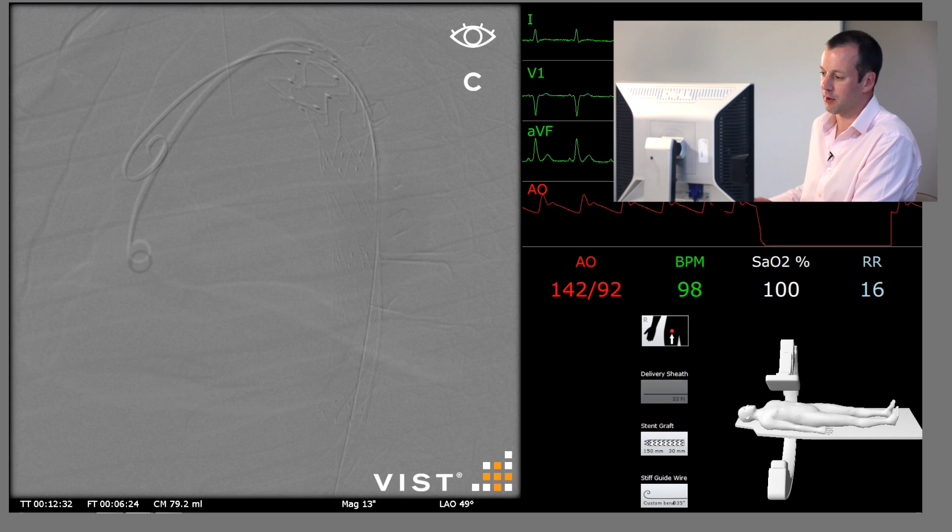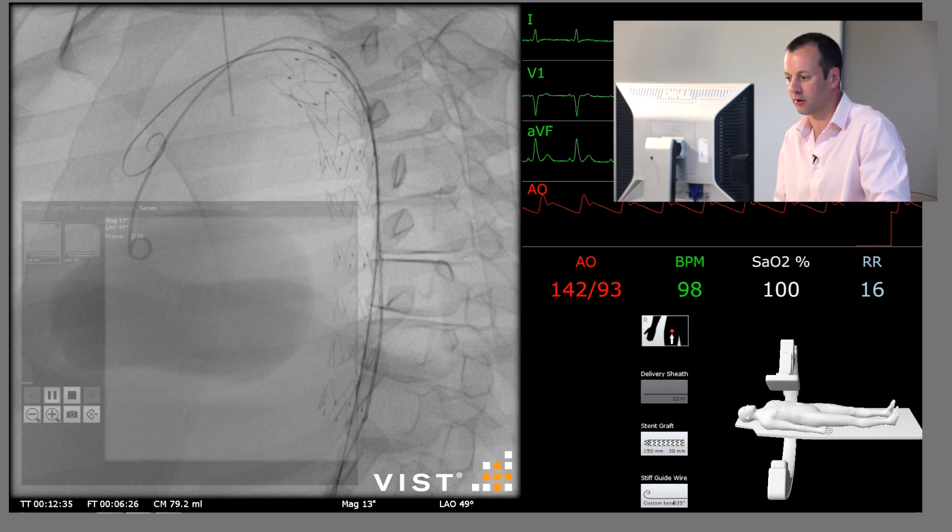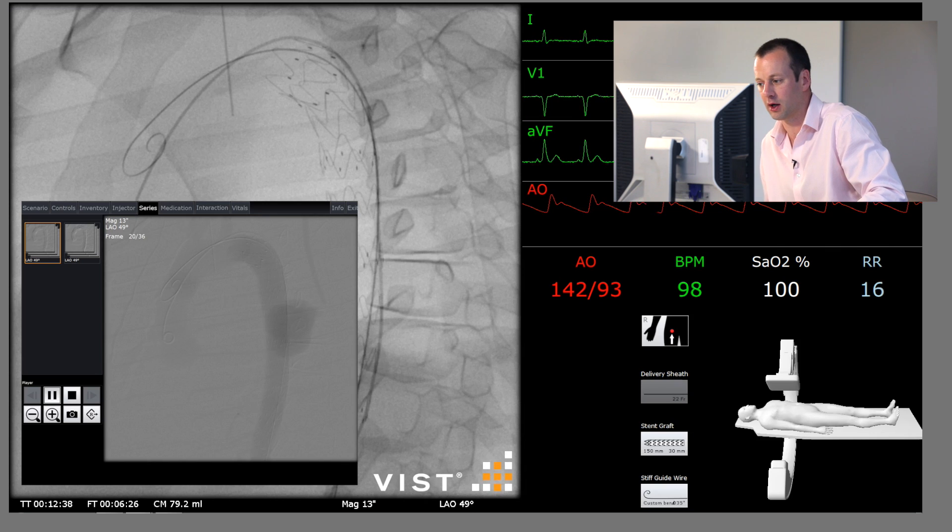We can still see filling of the ruptured segment, which suggests there's a large proximal endoleak. It's early filling, so it's a type 1 endoleak. What we need to do is put a molding balloon in and dilate this stent graft.